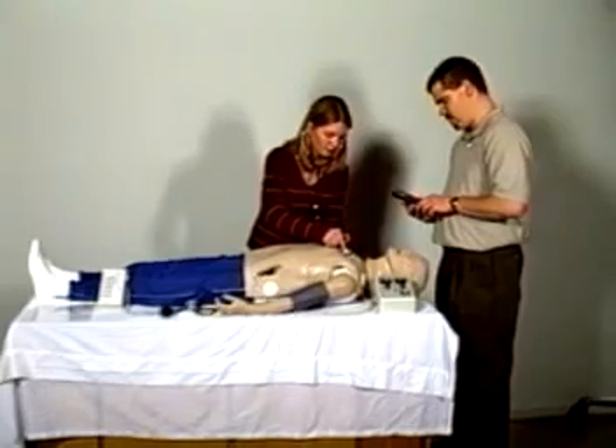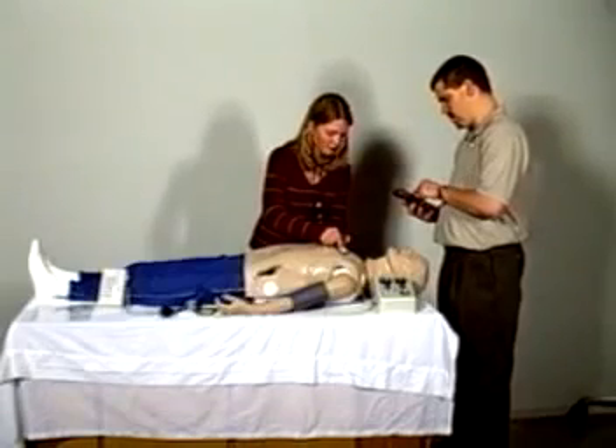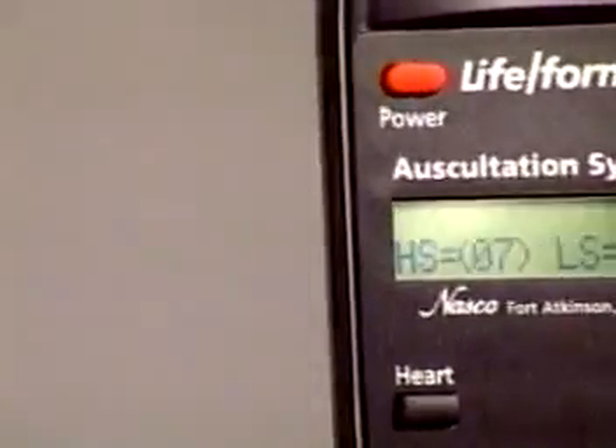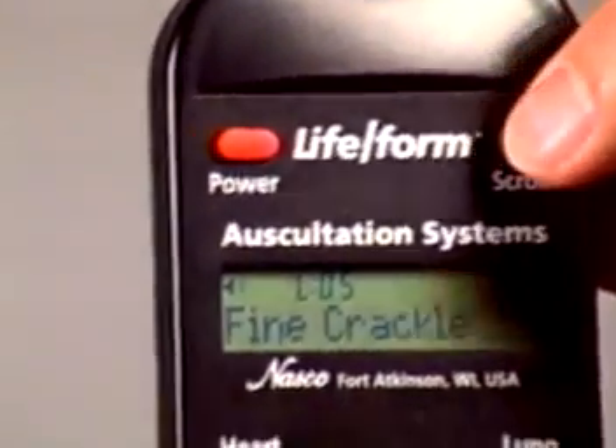The adult LifeForm crisis mannequin is now available with the new option of auscultation sites featuring heart and lung sounds. This unique technology allows the instructor to select from a menu of 12 heart conditions and 16 lung conditions using the wireless remote control.